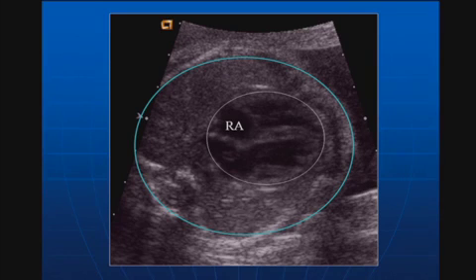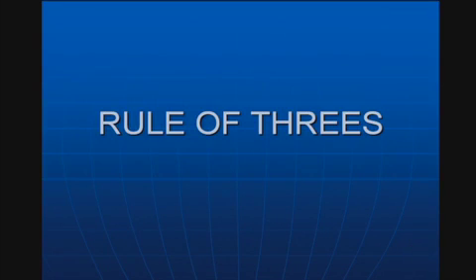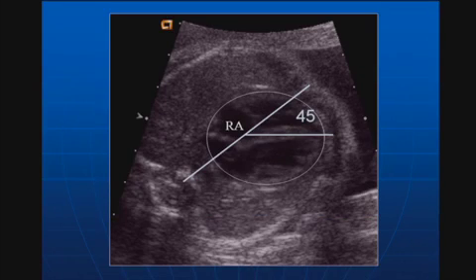So we can take the cardiac circumference, we can take the chest circumference. That ratio should be less than about 0.5. Or, as I like to do, take rules of 3. We get the heart here, we get another circumference of a coin here, we could put 3 coins in here. There's a little room for part of this coin that overlaps into this part, some of the other part of this coin that overlaps here or back into here, and that would be your rules of 3.